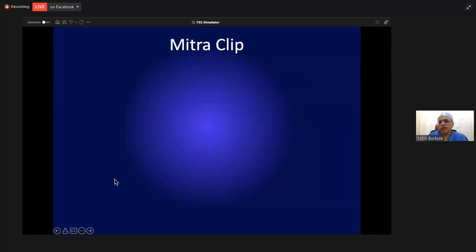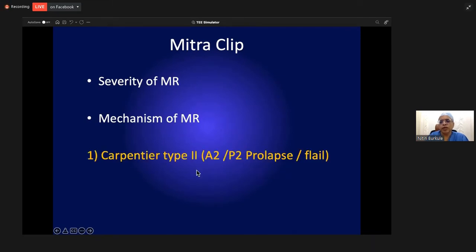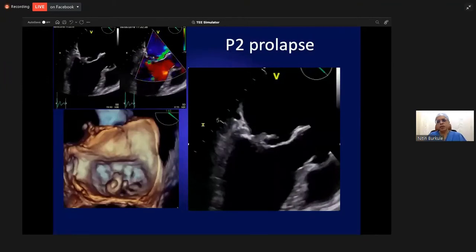Now these are the routine ones, and the mitral clip has made TEE center stage of your cath lab. Before you think of a patient for mitral clip, you should be sure about the severity of MR and the mechanism of MR. As you know, the Carpentier type 2, where there is either an A2 or P2 prolapse or flail, or the secondary MRs, these are the targets for the mitral clip. And TEE is useful to look for the suitability for the mitral clip.